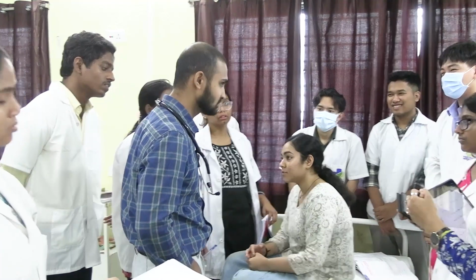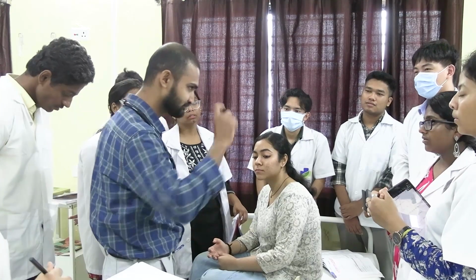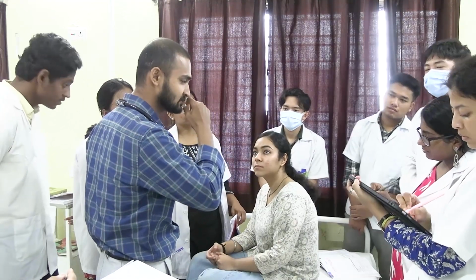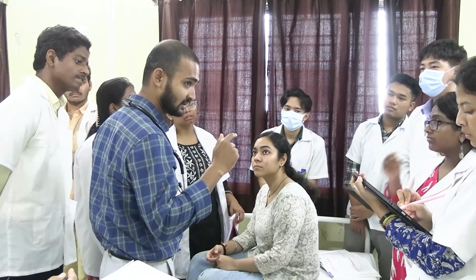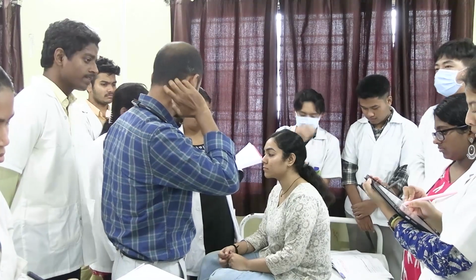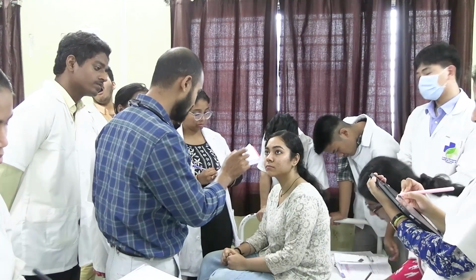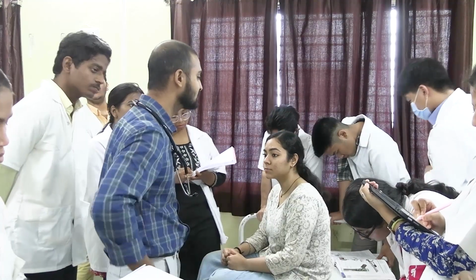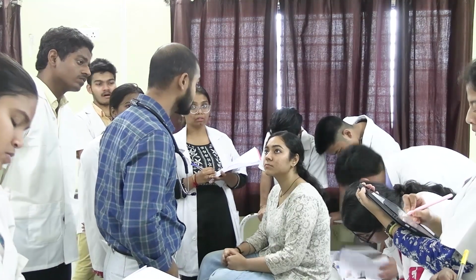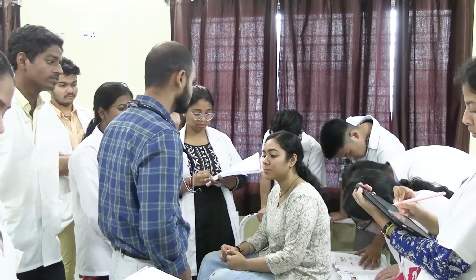The first phase is around 10 to 14 mmHg. It is a faint, clear and tapping sound. The next phase starts from 15 to 20 mmHg. It is a bit more than that of the first phase. It is a murmuring or musical sound. This is phase 2.